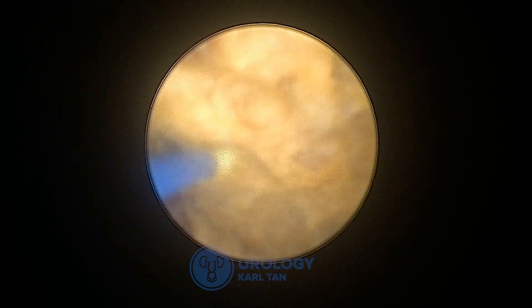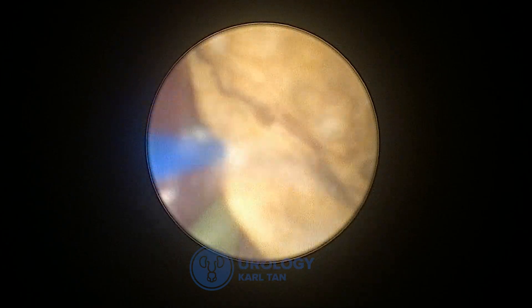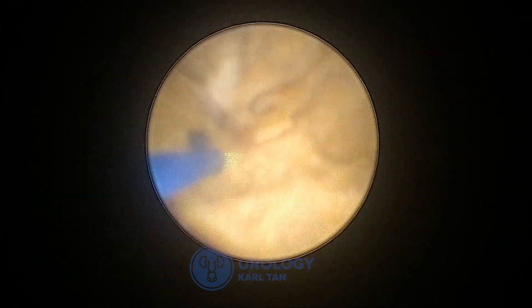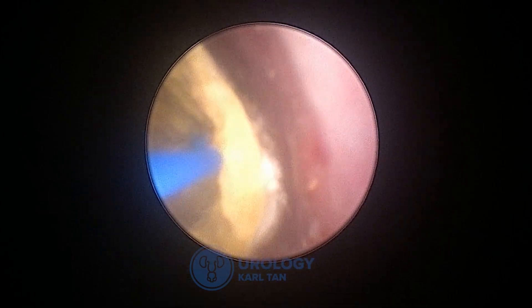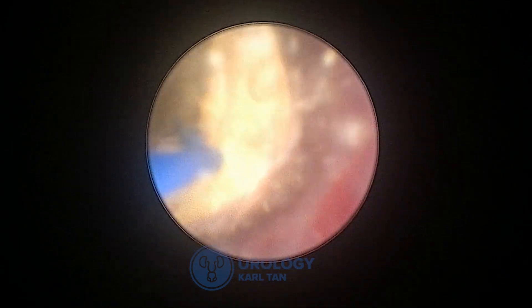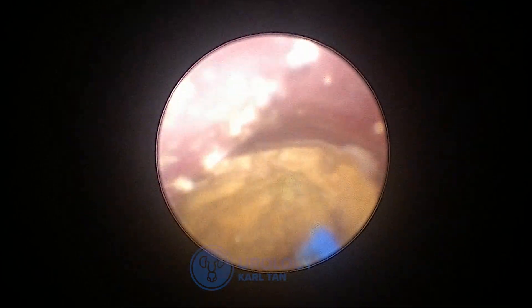What's important is that you have to avoid hitting the ureteral mucosa to avoid any injury. A lot of people think the Thulium Fiber Laser is dangerous — it's not the laser, it's the surgeon. You have to be careful and make sure you avoid hitting the ureter, so that later on you won't have strictures that become a problem for your patient. Once you have enough space between the stone and the ureteral mucosa, you can start lasering the edge of the stone after completing the core.